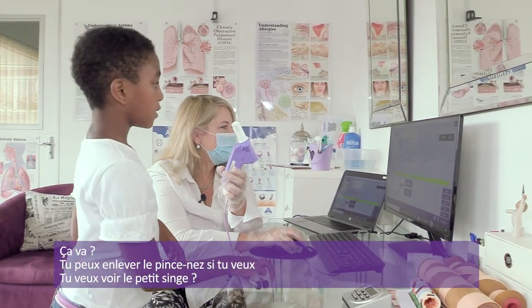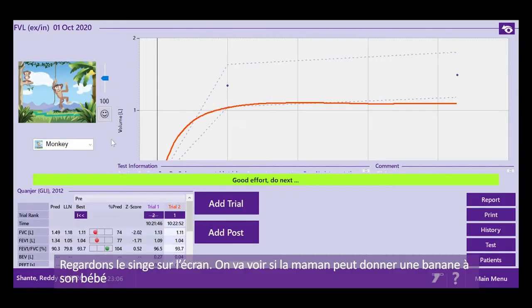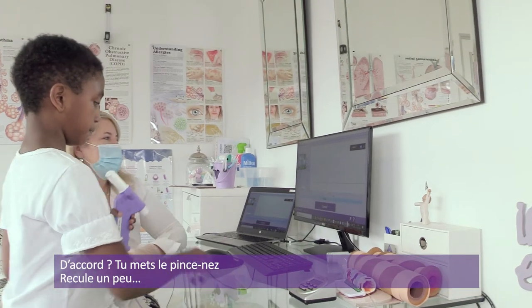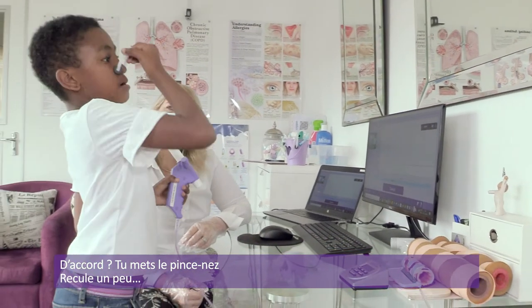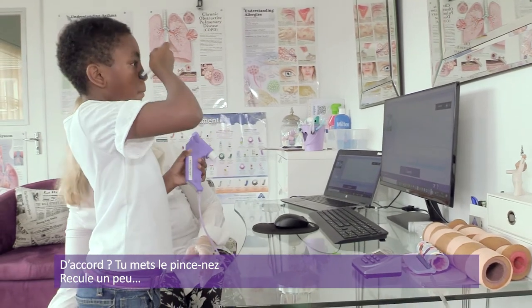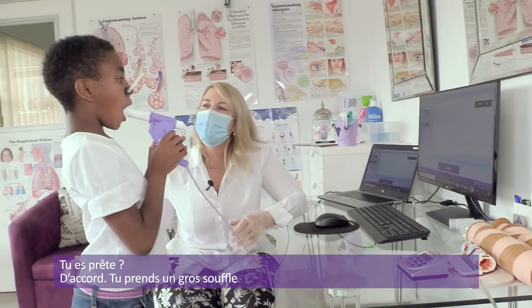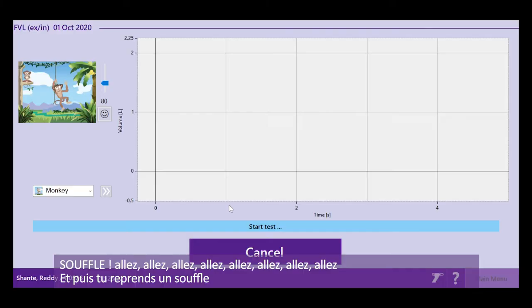Do you want to see the monkey? Let's watch the monkey on the screen and see if she can give her baby a banana, okay? All right, nose clips on. Let's step back just a fraction. Step back just a little bit, that's it. Okay, you ready? Okay, big breath. Okay, fast as you can.